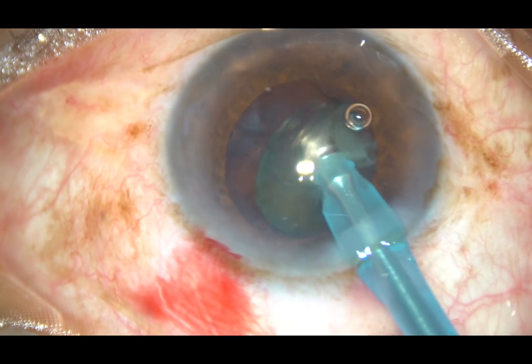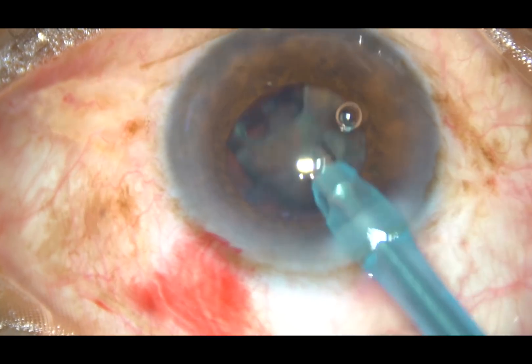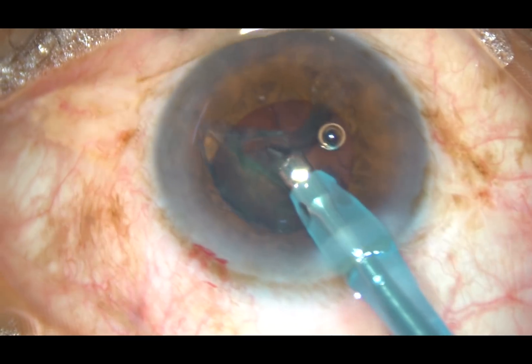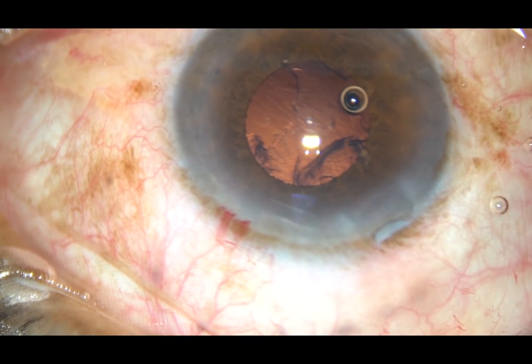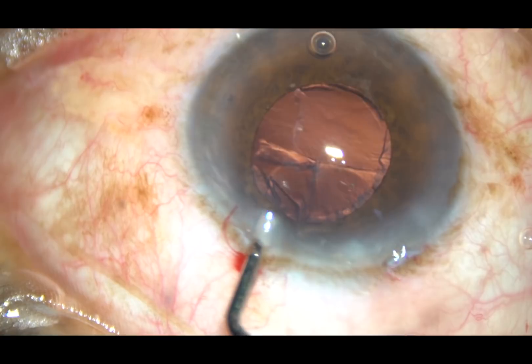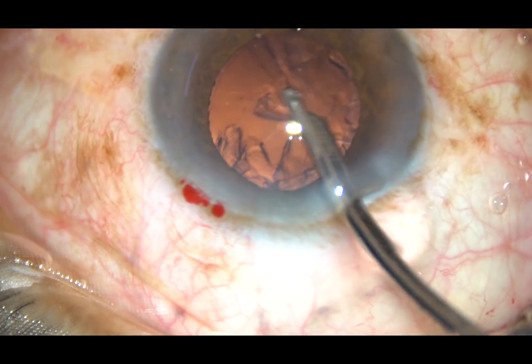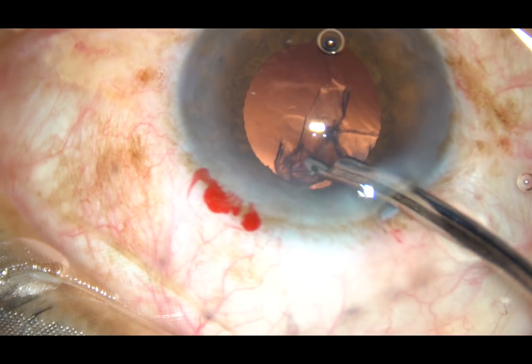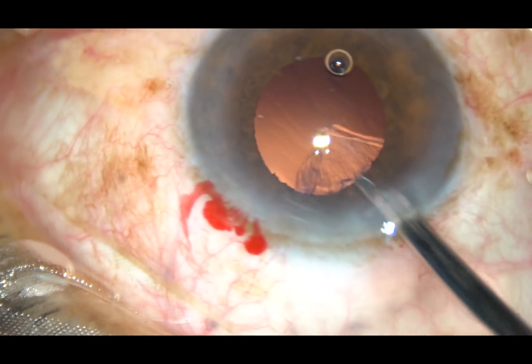The pupil was okay, and during emulsification of the last piece, the pupil is becoming small but still I can manage. That's it — the nucleus is managed single-handedly. You can do this: just chop the nucleus into fragments, come out, reposition the iris, inject viscoelastic, and then emulsify the nuclear fragments single-handedly. And you will see that the pupil is round and quite adequate in most of the cases.